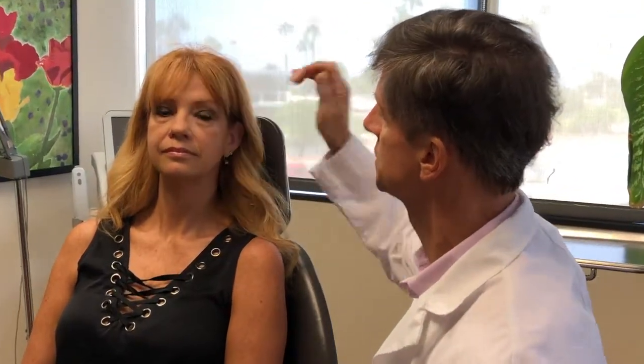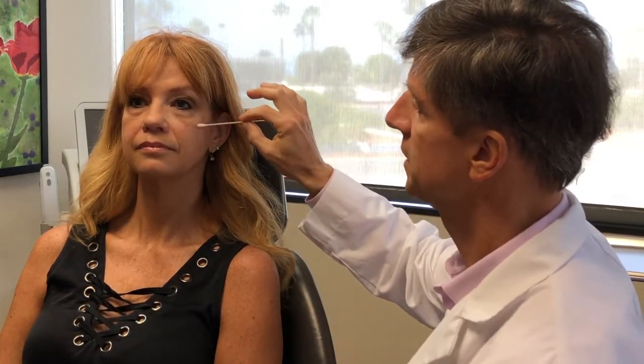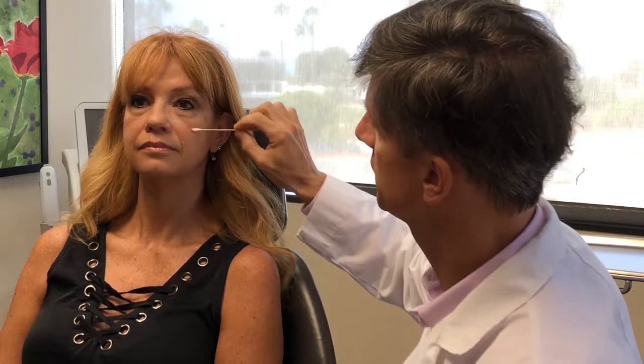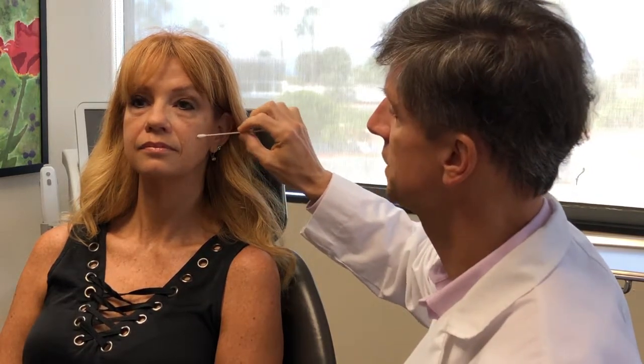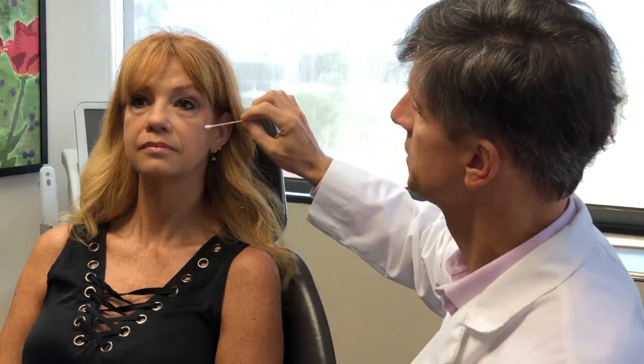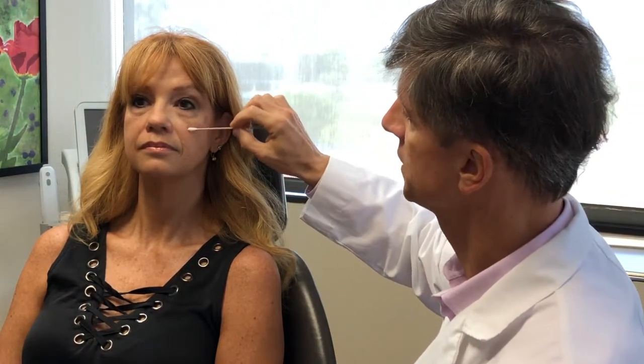We are going to be demonstrating malar augmentation and safety techniques around how to perform this effectively and well. What we see is an area of a malar mound. We have volume loss that has taken place in the midface and in this malar area. She has kept the volume of the medial fat pads, and so what we want to do is bring this area up.